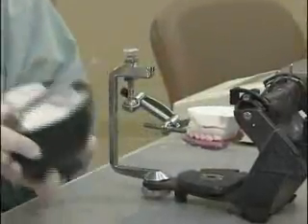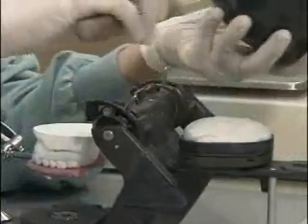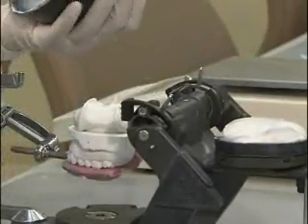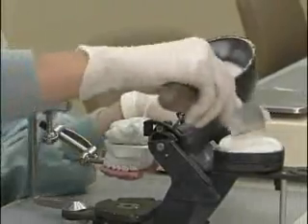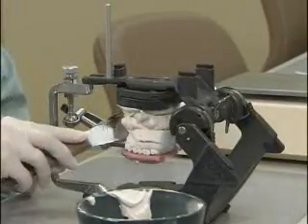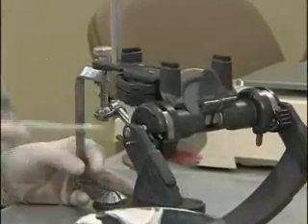Now open the articulator and apply the stone to the upper cast and to the mounting plate. If this is done carefully, we can complete this process in one step without having to add any more stone. Close the articulator and wipe off the excess stone. Do not reopen the articulator until the stone has set thoroughly.